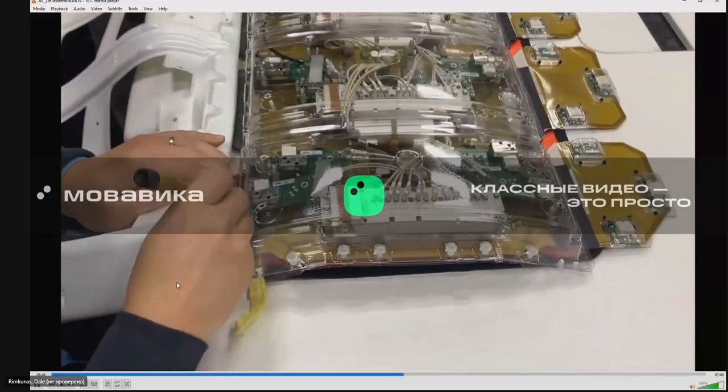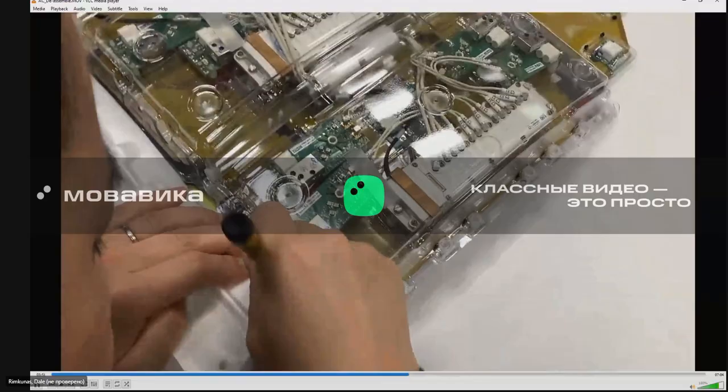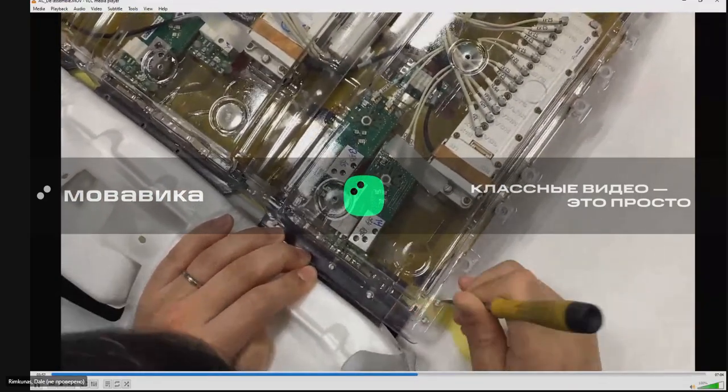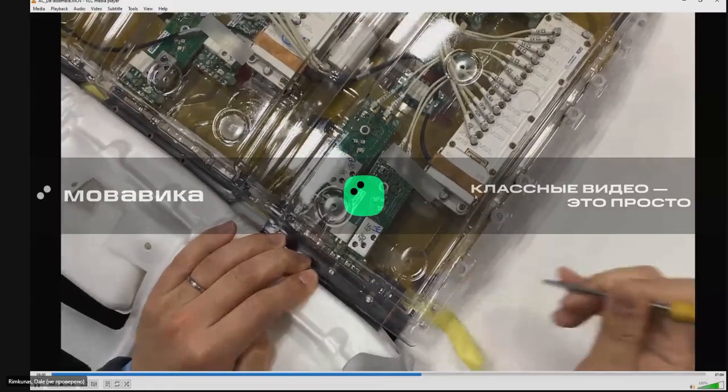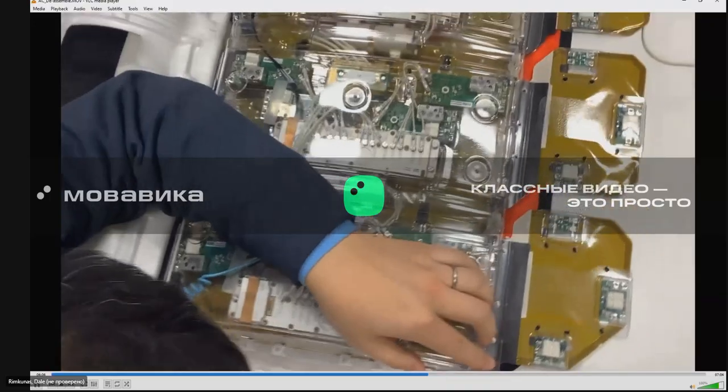What you have to do is just push it right there. Push. Go all the way around the perimeter of the coil to pop those out. Push. Get the clear plastic housing off. Push, nice and easy. Here, you just have to push.